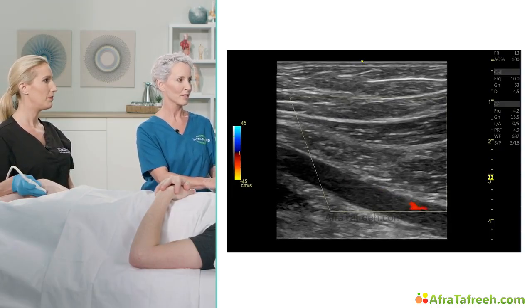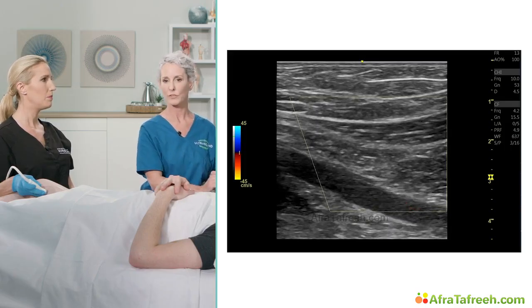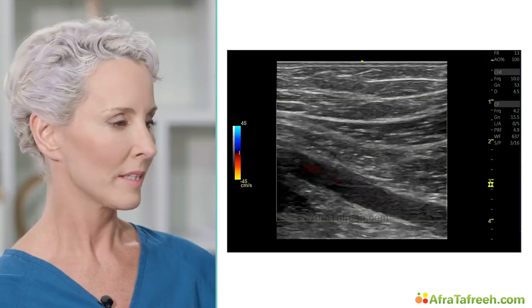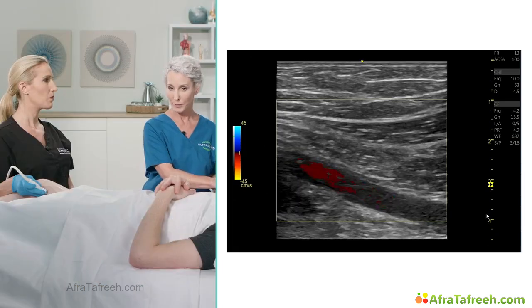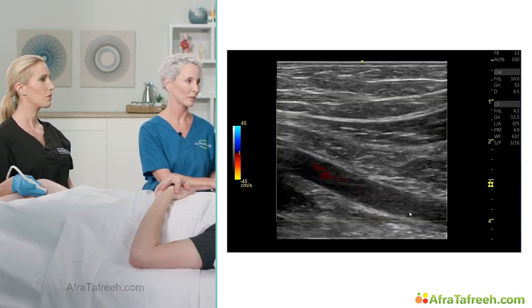And at this level, we're actually losing our color flow filling. So there are some things that you can do to improve. One of them would be to center steer. Anytime you get to a depth of 4 centimeters or greater with this type of transducer, you will begin to lose the penetration and the power of your color Doppler.